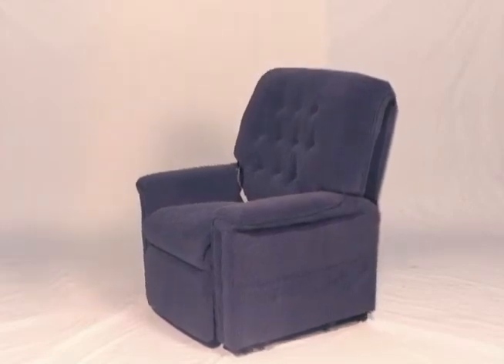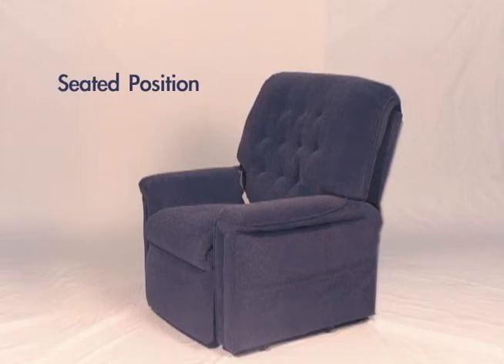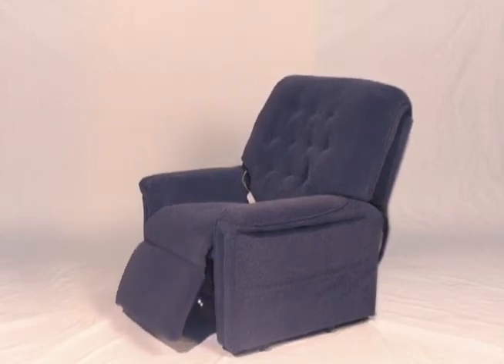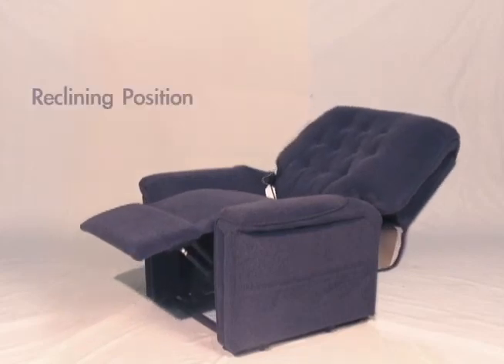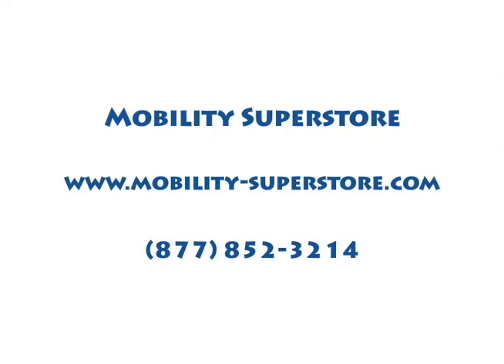A three-position chair also has simple controls that make it easy to adjust the chair. The adjustment can be anywhere from sitting fully upright to sitting fully reclined.